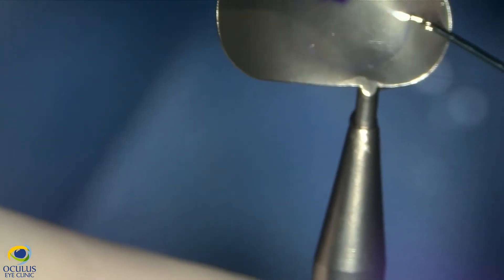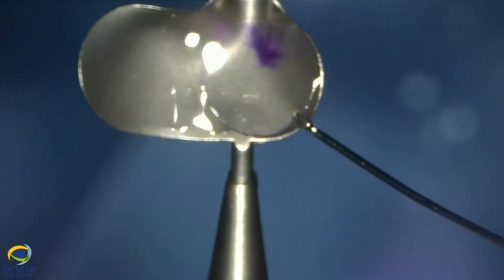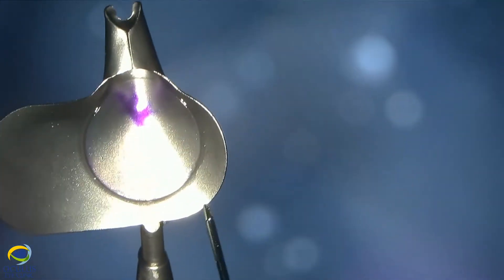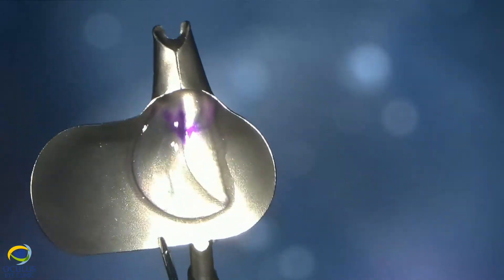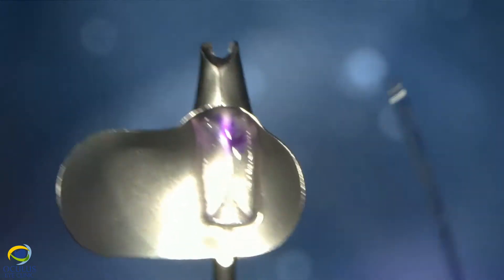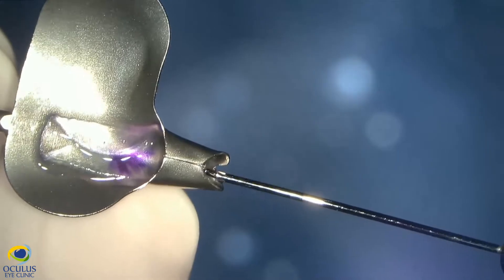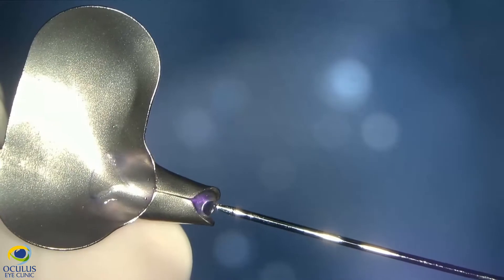We aimed for a thin lamella of 80-90 microns, which is more difficult to handle in the anterior chamber but has the advantage of faster visual recovery for the patient. We folded it very carefully in the Busin glide with gentle manoeuvres and pulled it to the margin of the Busin glide.